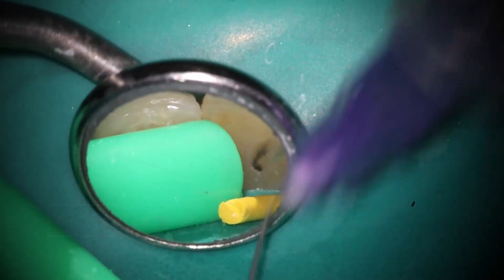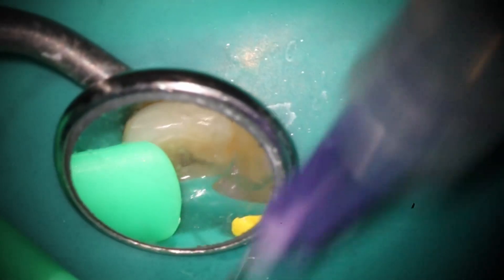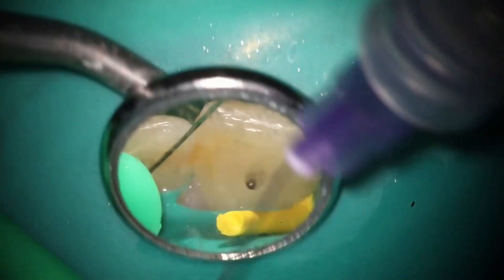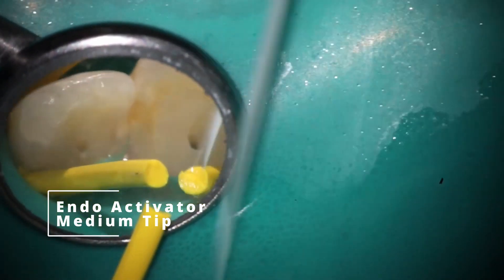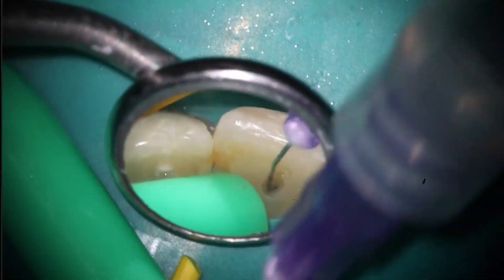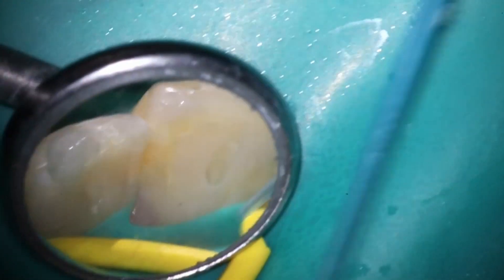We're going to go ahead and rinse here. I did a lot more rinsing than I would normally — I actually cut some out. I rinsed with an entire thing of Triton as well as a couple things of bleach just to try to get this thing dry. One of the tricks you can do when you have a case like this that's semi — are you going to be able to get it dry or not — is to go in with that activator to try to clean out as much as possible.